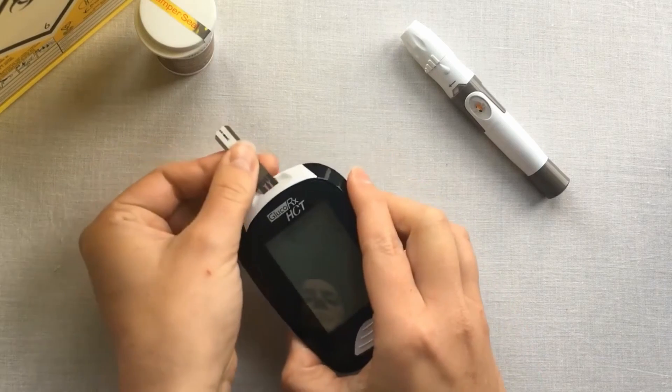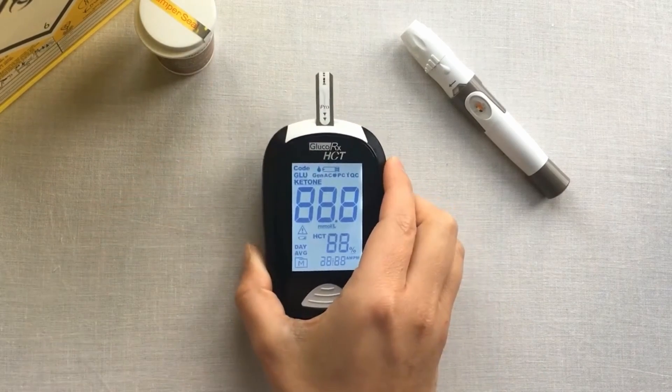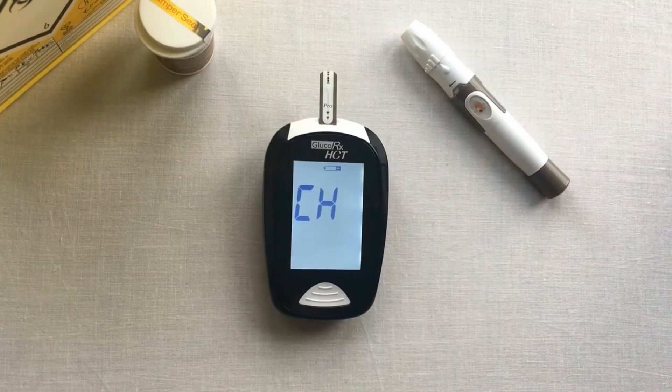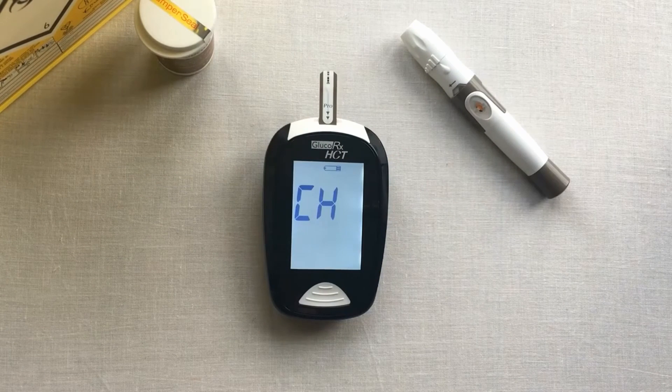With the meter turned off, insert your test strip into the top of the meter. The meter will automatically identify if you are using the blood glucose or ketone strip.